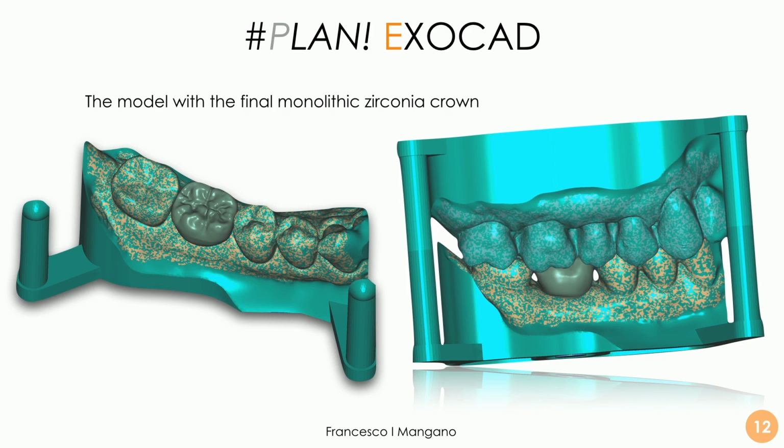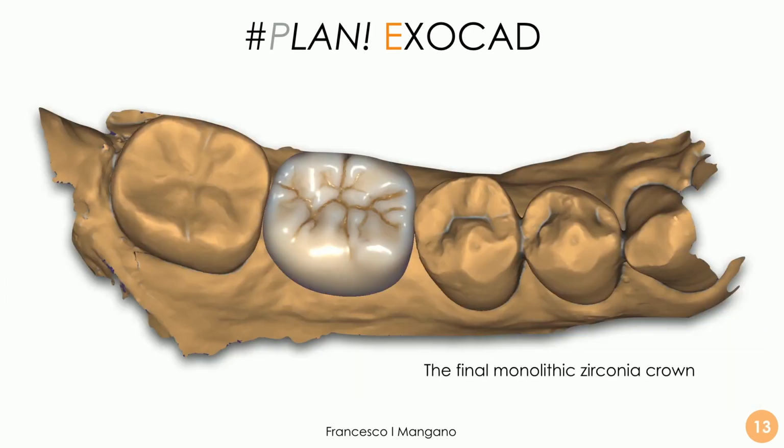If needed, for example if we are working with copings, so we're working with a framework, then we need to print the model every time, and there's no possibility to skip this phase because the dental technician needs to veneer over the copings, over the framework.